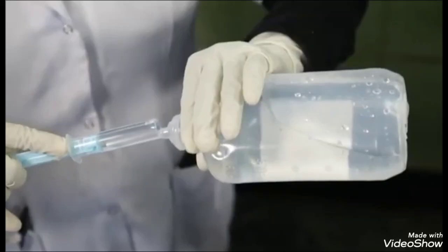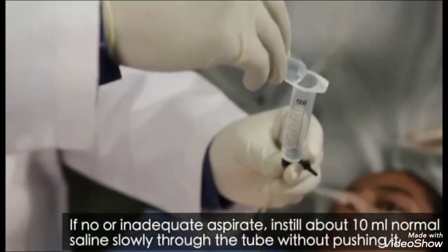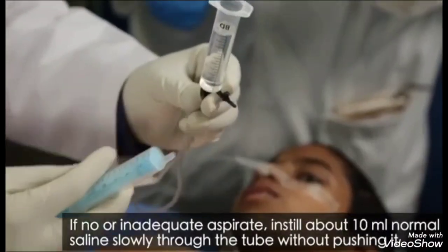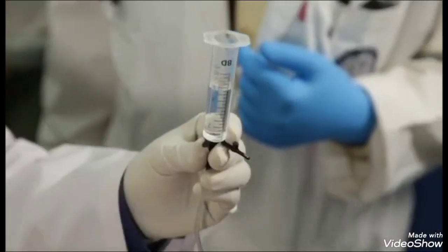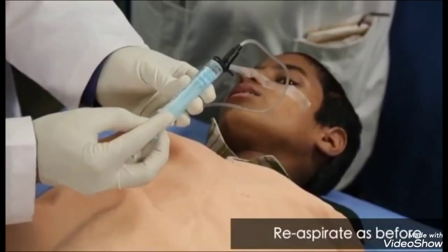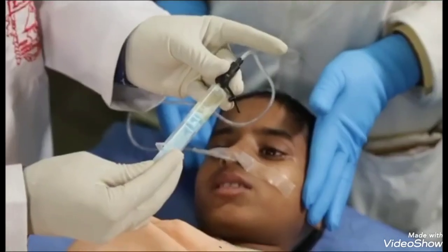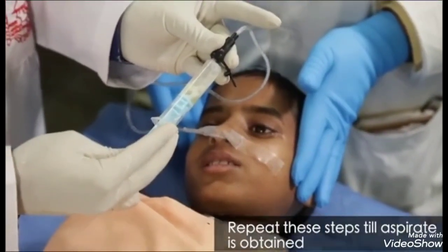In case direct aspiration fails to provide adequate specimen, one should instill about 10 ml normal saline through the tube slowly. Align it to gravitate on its own. After instilling, re-aspirate, rotating the patient through supine as well as left and right lateral positions. Repeat these steps till gastric aspirate is obtained.